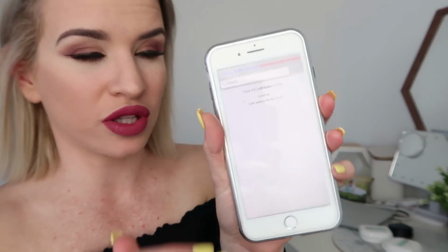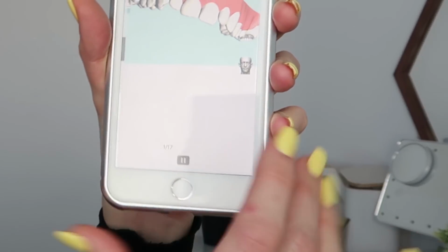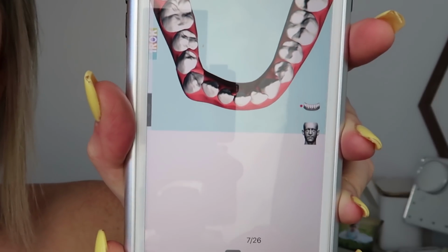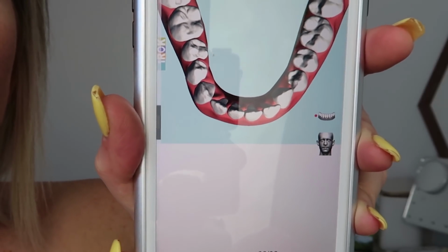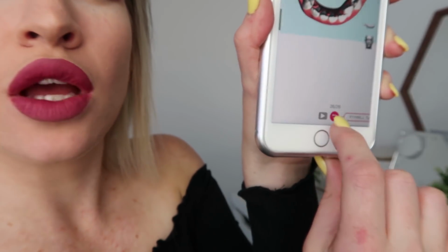There's this program, it's like an app, and I don't really like this program, to be honest with you. It's not that easy to work out. So this is my plan, and then you can just touch the top or the bottom and hit play, and it will take you through each stage of movement. So it just shows you the plan of what's gonna happen, and it shows you per set. So what's gonna happen per each set. Yeah, so that's my plans. I was happy with that.